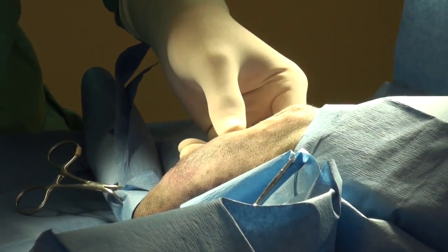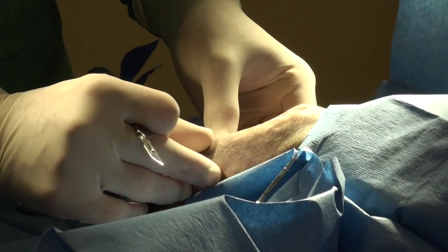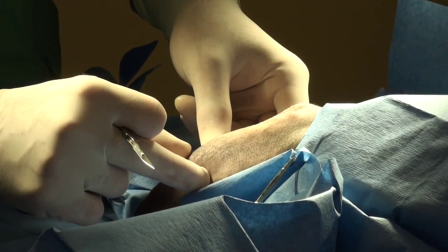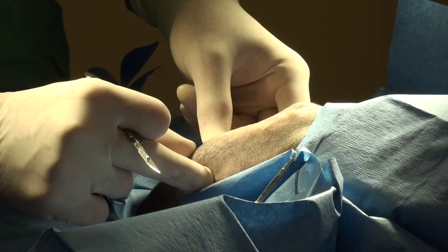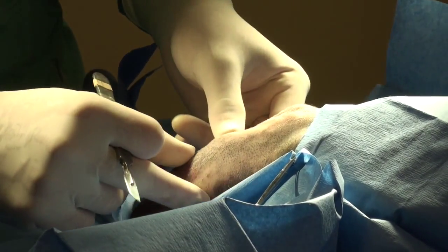I want to go ahead and incise the skin. It's really, really inflamed. This fracture happened — let me see — I believe about three or four days ago. You can see the degree of inflammation in this area and hemorrhage.